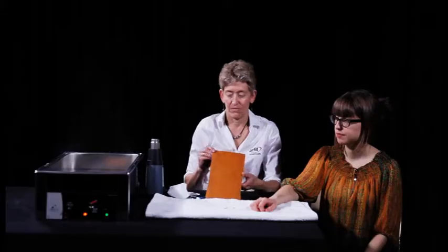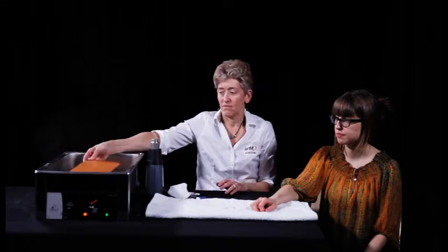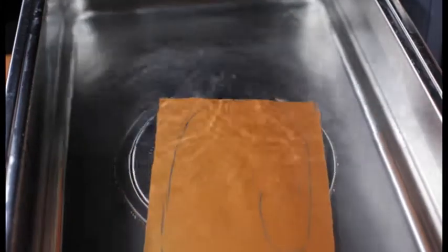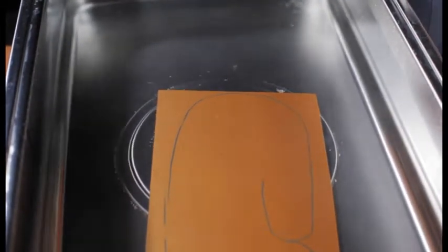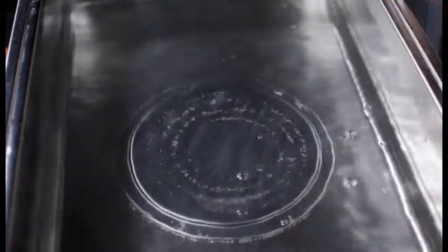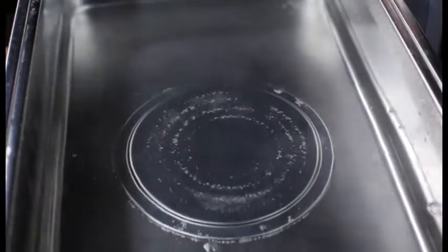Draw the patient's hand on a paper towel and make a pattern of the orthosis, which is then traced onto the thermoplastic material. Place the material briefly in the hot water to soften prior to cutting out the pattern. After cutting out the pattern, place the material back in the hot water to completely soften and activate.